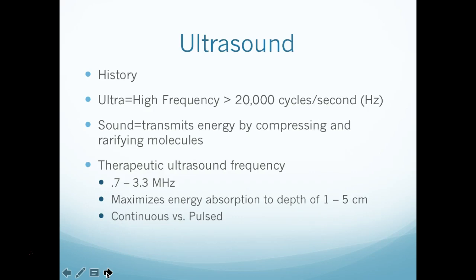I think they discovered it originally around World War II when they were trying to do sonar with submarines. And then they realized that they could use it therapeutically. And so that's kind of where it started. It's a high frequency greater than 20,000 cycles per second, which is measured in hertz. And that's the abbreviation for hertz, which is nice for you to know for when you're going to do documentation of things. The sound transmits energy by compressing and rarefying those molecules, and that's what creates that energy.